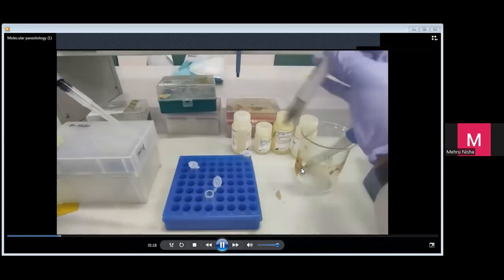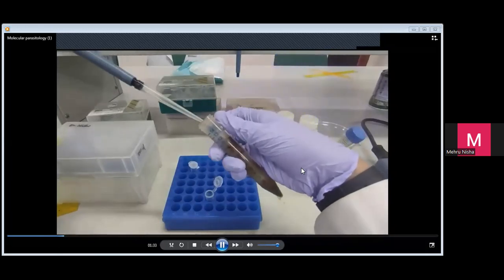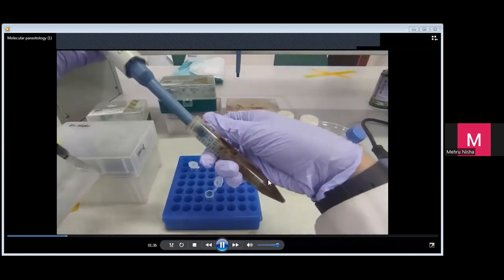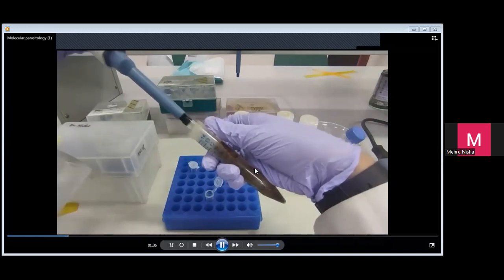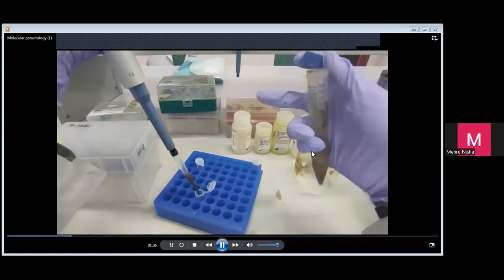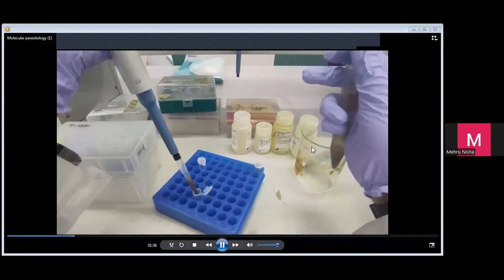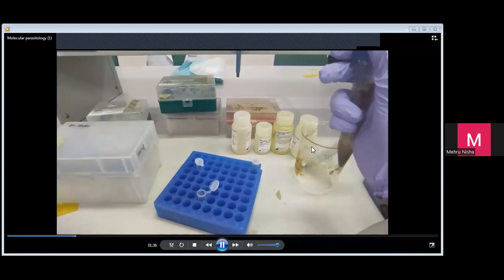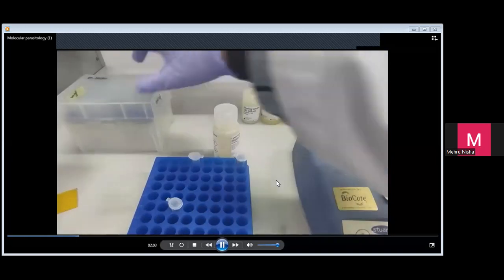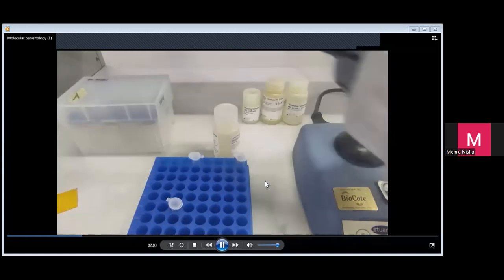Despite it being a stool sample. So that's why you have to filter it. Otherwise, the pipette cannot go in if a lot of things are there. So this part is a bit difficult with stool. Some stool, if the patient is constipated and so on, is very difficult to pipette. So you need to put sodium chloride to dilute the sample. Okay.